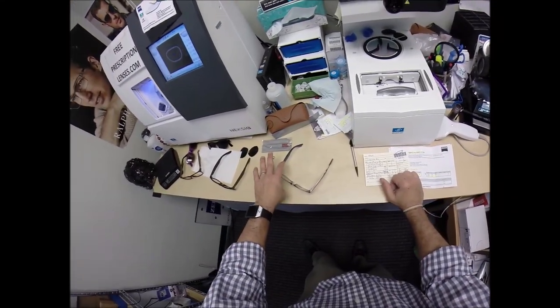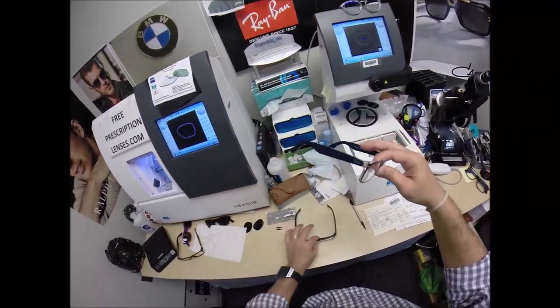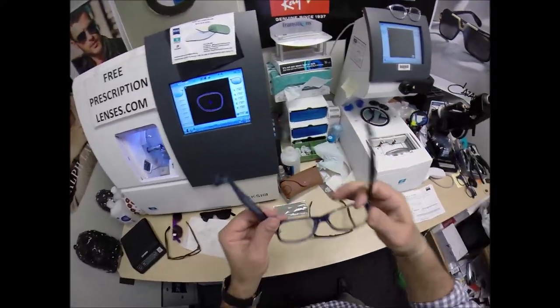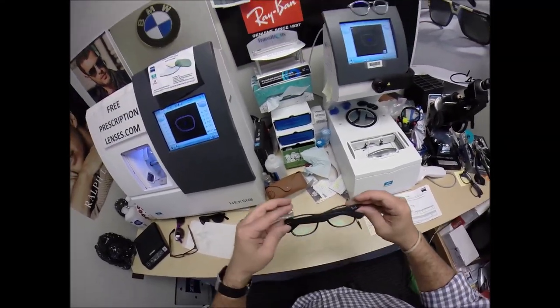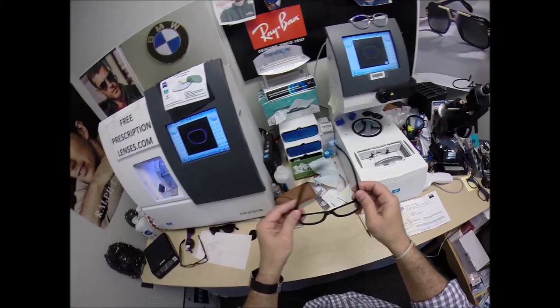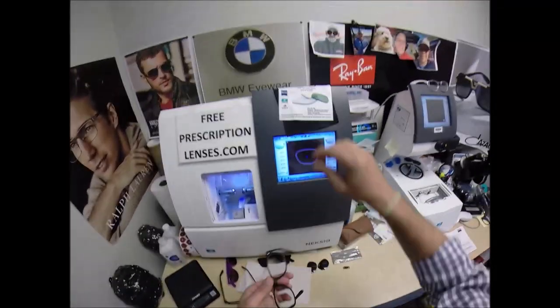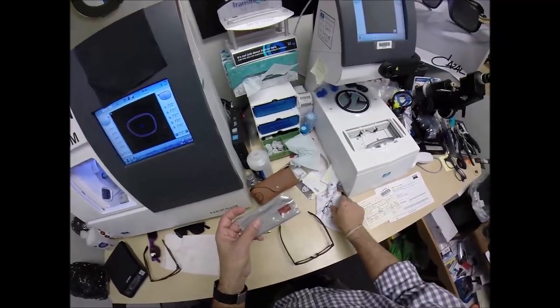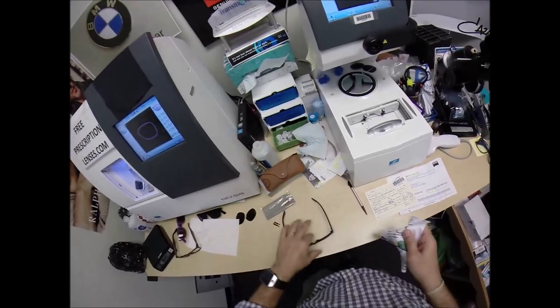When I take mine off and press down, they wobble on the counter, but they sit level on me. I'm wearing the same frame in color 6053, which is the blue crystal. Flip this over, press down — there is no wobble. Close each temple to make sure they overlap perfectly. Check the tension on each hinge — if one was tighter or one was looser, I would adjust them so they're matching. I also send out cleaning instructions in every video, not only for your frame and lenses, but for the Ray-Ban cleaning cloth, the premium microfiber cloth, and a Zeiss cleaning cloth.